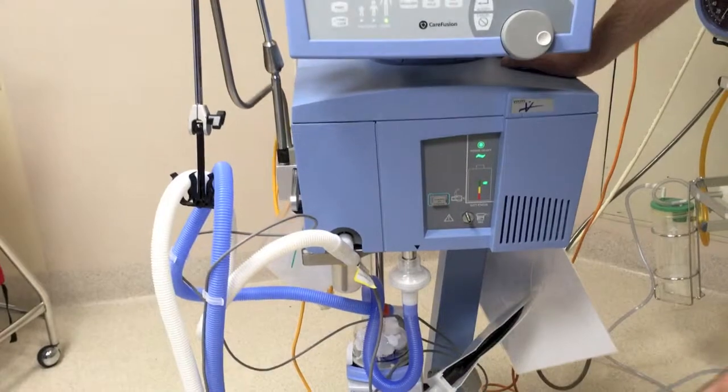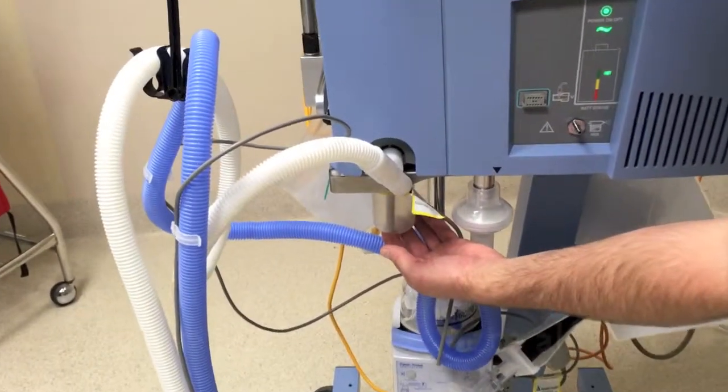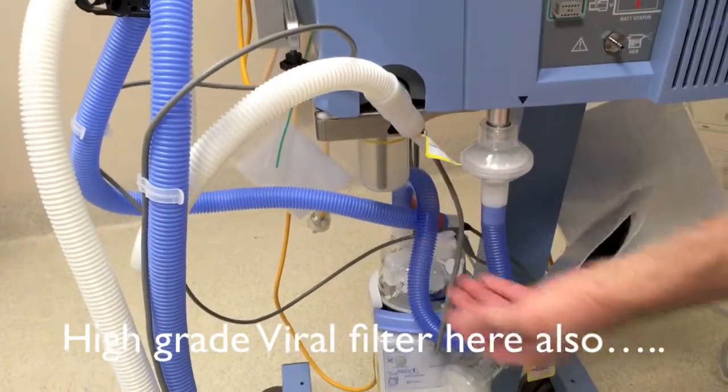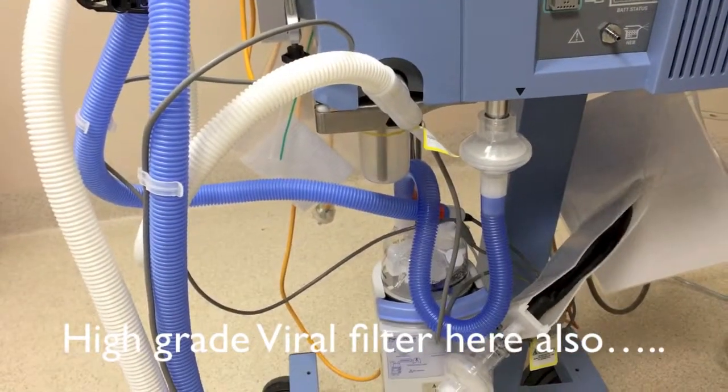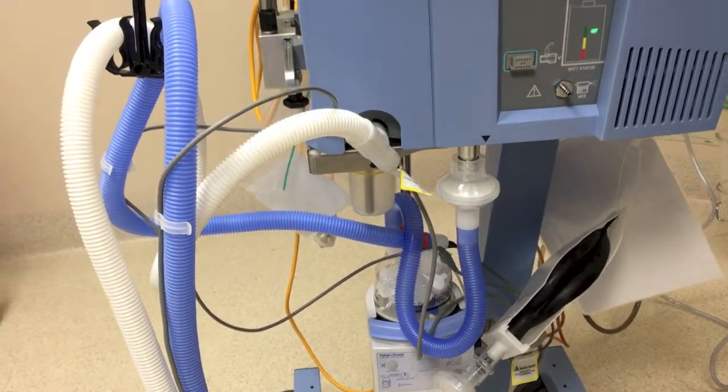Unlike the XL, there's a collection port here to collect the rain out. You do need to just check that this doesn't get full of fluid. If it is, you can simply unscrew it and empty the fluid out while the patient is still ventilating.